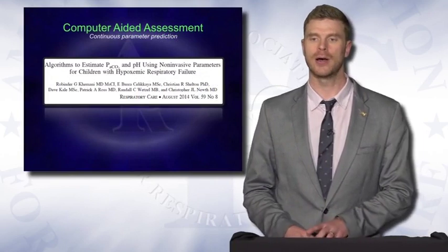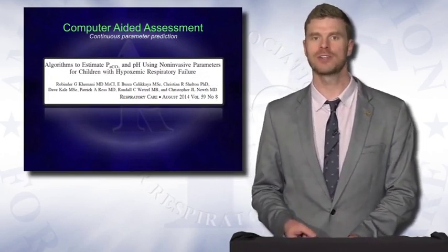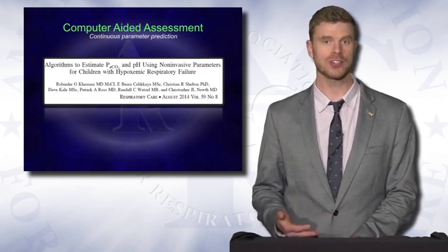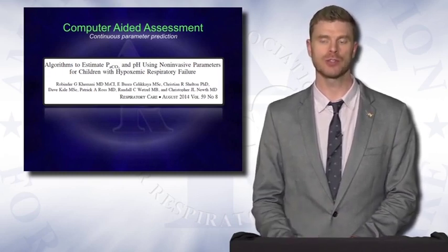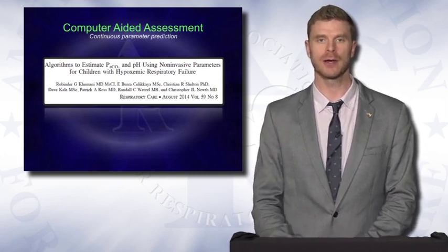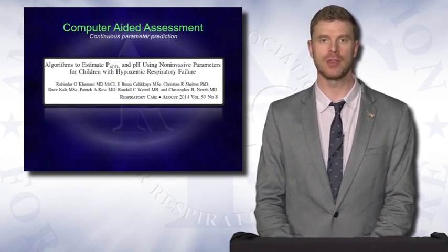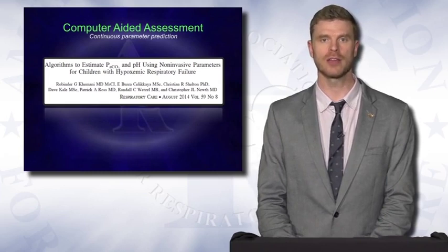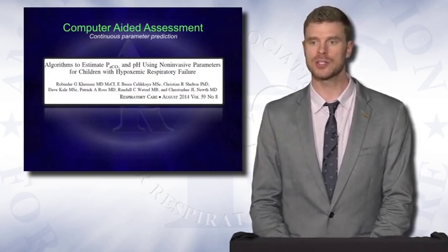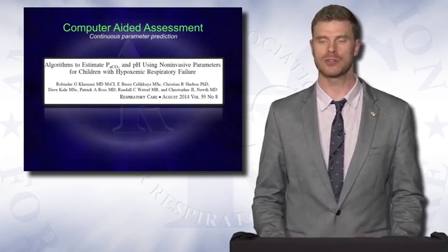And last, we would all love to have a non-invasive, continuous dynamic assessment or estimate of PaCO2 in our patients. Many of our protocols and our practices call for specific PaCO2 levels that in some cases we'd like to keep very, very tight for some important physiologic reasons. This study was published in Respiratory Care in 2014.